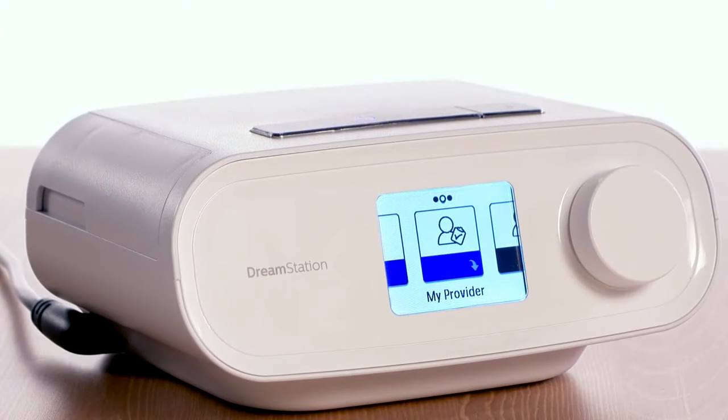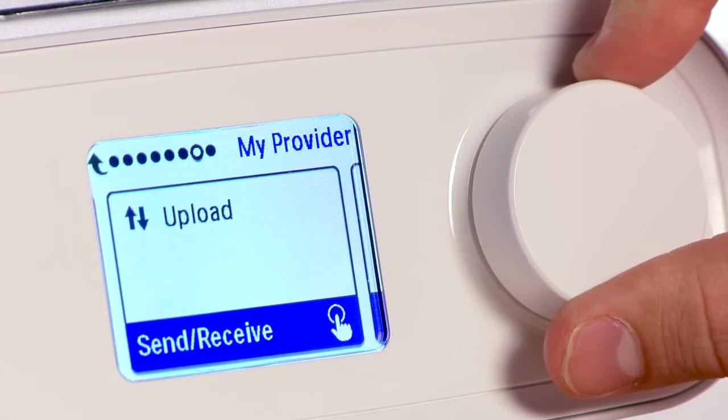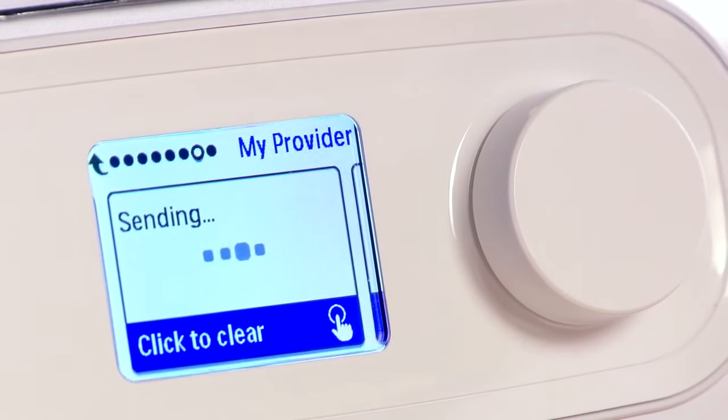Your provider may ask you to execute a manual upload of your data. If requested, go to the My Provider menu and navigate to the upload screen. Press the control dial to initiate an upload.